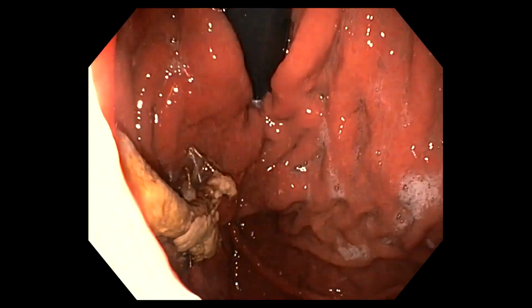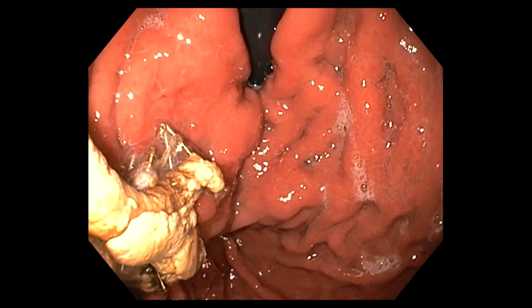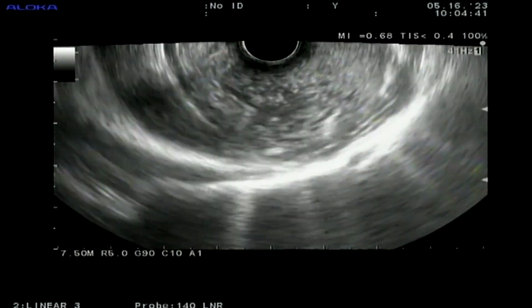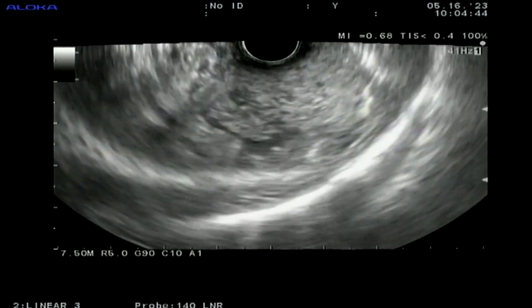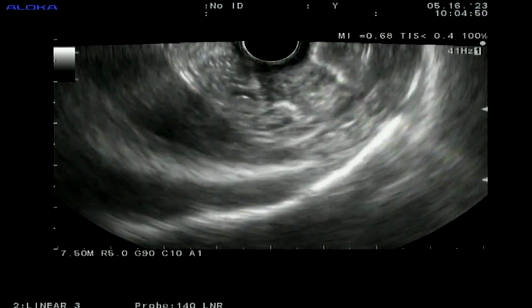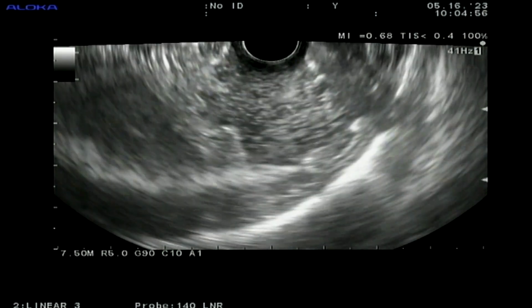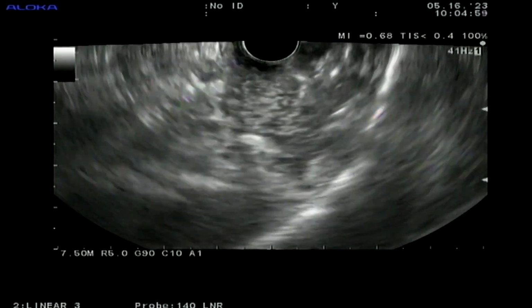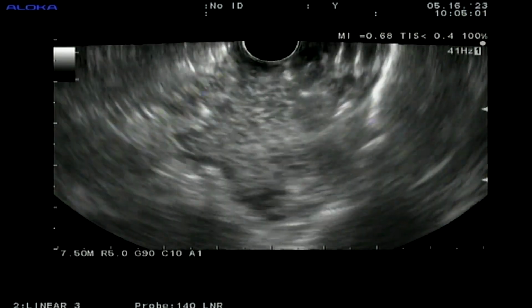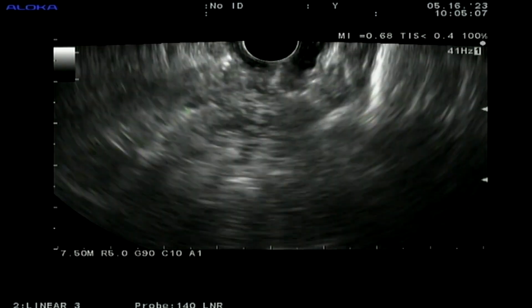And you see the varices look obliterated now. All we see now is the coil and glue extruding. All right, so we'll switch to the EUS and we'll take a look and see if any further treatment is needed. All right, so we've switched now to EUS. You can see we've instilled water into the stomach and the fundus area. There's some bubbles here. It's starting to settle down, but we're seeing to the right of the balloon a shadowing. That's the glue and the coil all in this area here. It's extruding, and we're not going to see very well because of the shadowing.